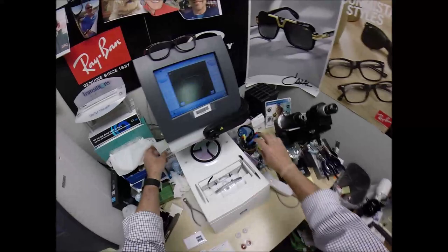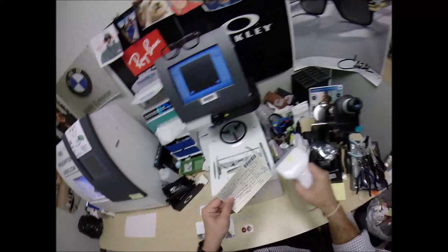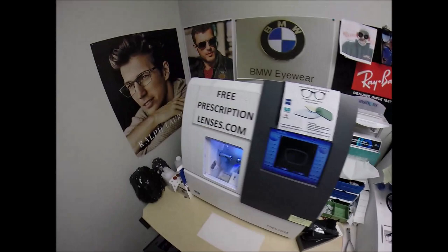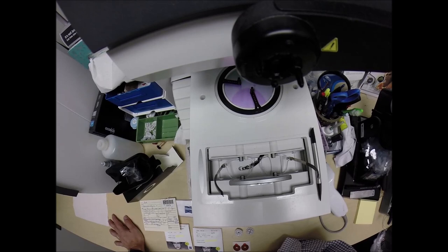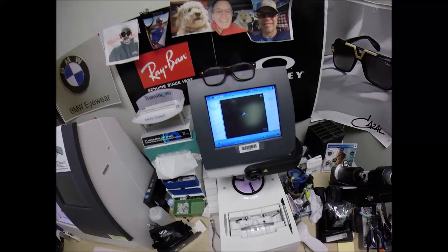I'm going to place your frame into the tracing element of my blocker. One thing I need to do first is assign a number to your glasses — you are secret agent 2679, because 007 is already taken. I'm going to hit the start button, a little stylus is going to pop up, go around, and trace the inside bevel of the right side of the frame, before doing the same thing on the left, here at freeprescriptionlenses.com, where everyone loves a bargain and no one is disappointed in quality.